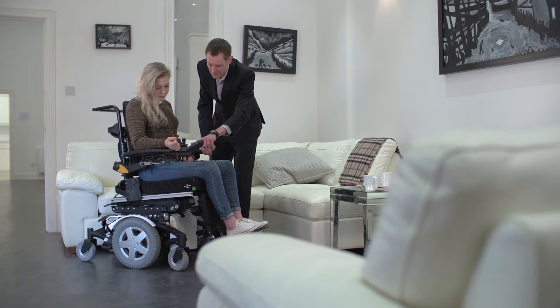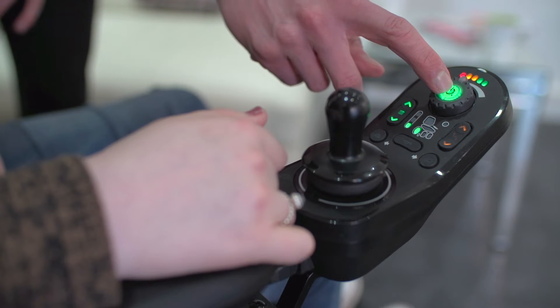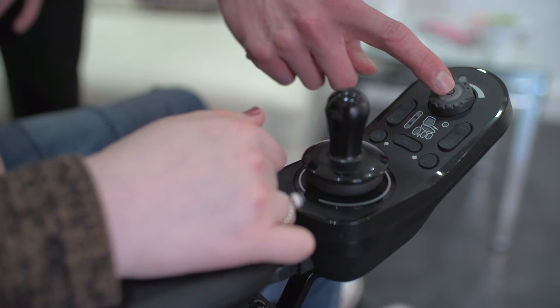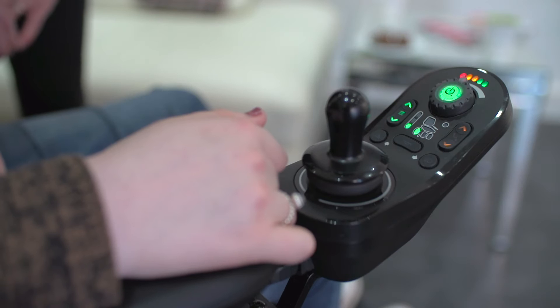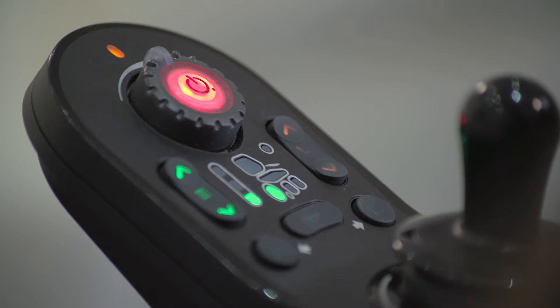Operation. The on-off button is located at the front of the remote. Designed for a wide range of users, the button is large for easy targeting and has a defined action to give user feedback that the button has been pressed. The on-off button also shows the system status. A green light shows the system is powered up and ready, and a red flashing light indicates an error which stops the power chair from operating.